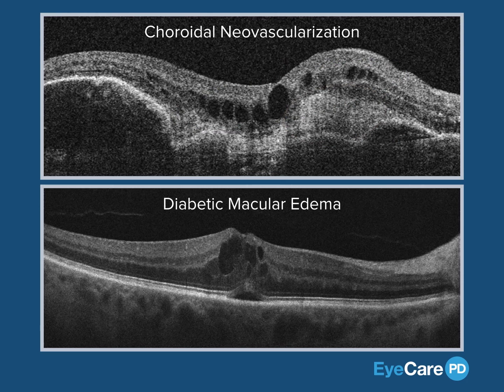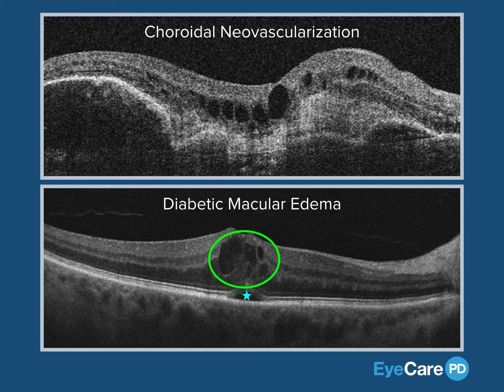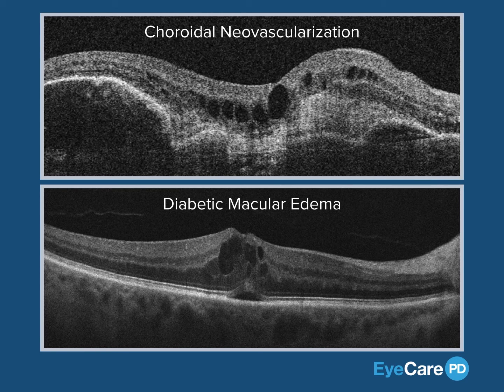Meanwhile, in the bottom image, you can note intra-retinal fluid with speckling, or reduced intra-retinal pixel reflectivity, in combination with a small amount of subretinal fluid. Notably, there is an absence of retinal pigment epithelial abnormalities. This image is thus most consistent with an OCT from a patient with diabetic macular edema.